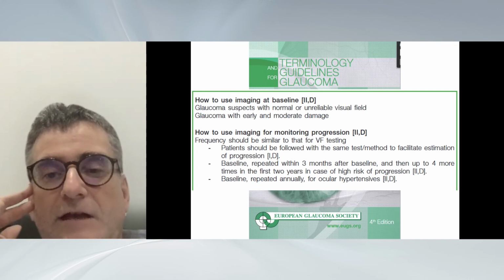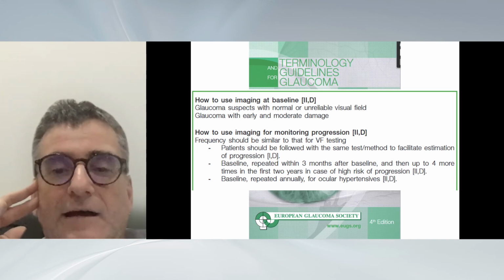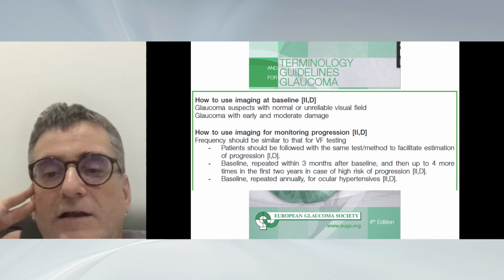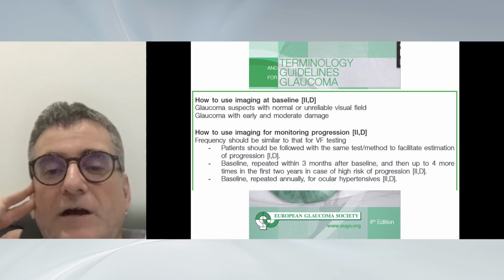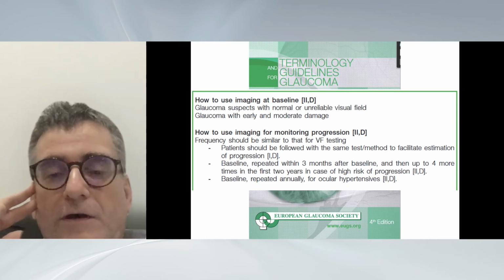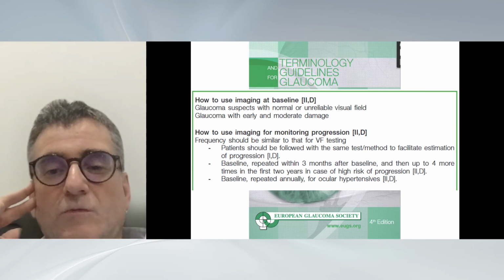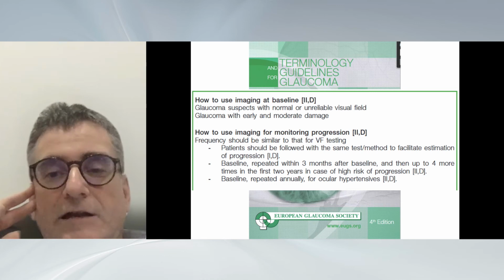And at the end of the day, if you want to have a clear diagnosis and look into progression of the disease, nowadays we think that it's state of the art to do both the OCT and the visual field at the same time. And I think all glaucoma specialists would more or less nowadays agree that this is state of the art. Next slide.